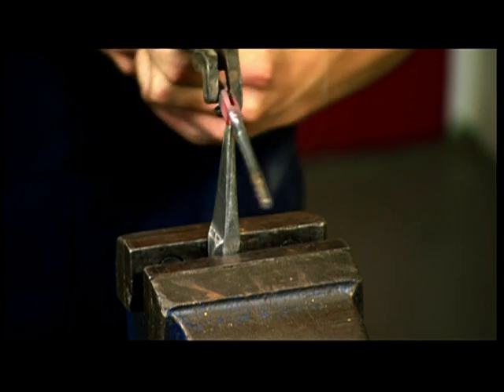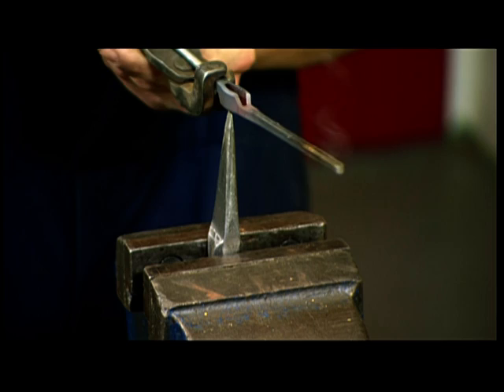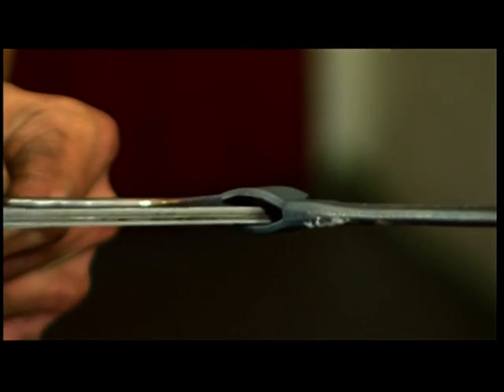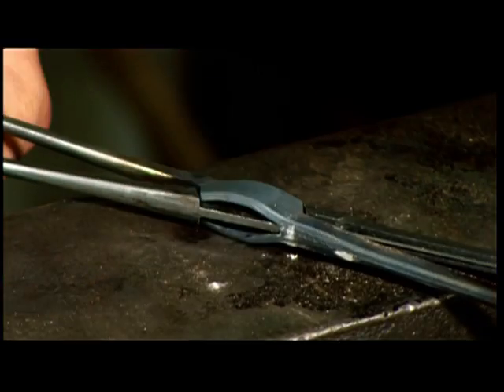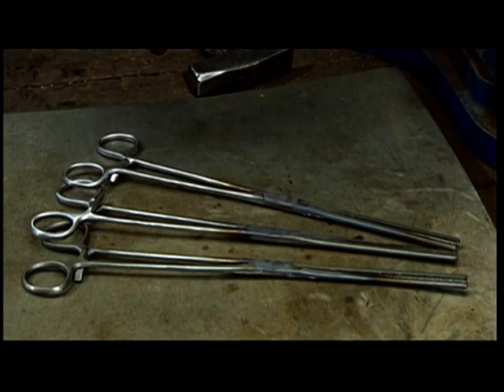malleable. Then he forces a spike through a slit in the joint, and the now compliant steel stretches to open the slit. The other shank now slides easily into the opening. He hammers the joint to close the opening, and the two arms of the surgical clamp are now hinged together.